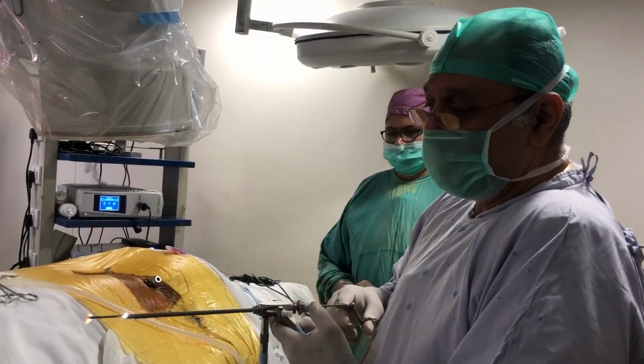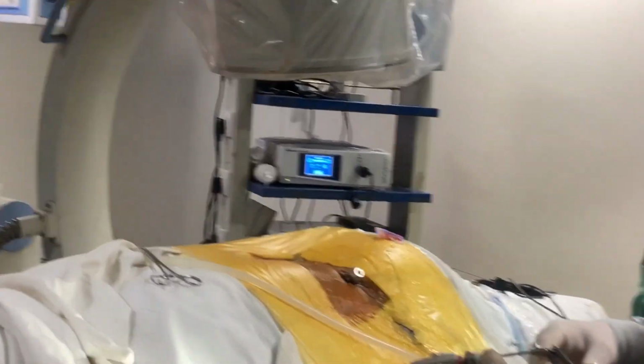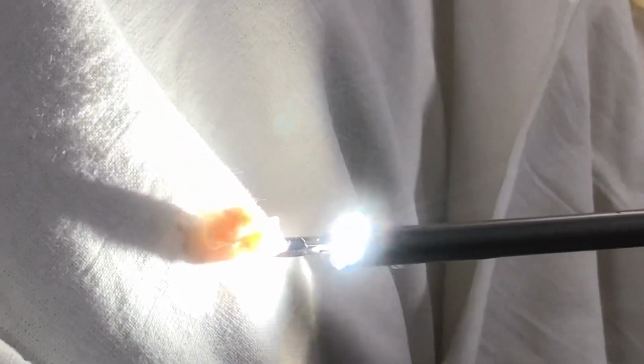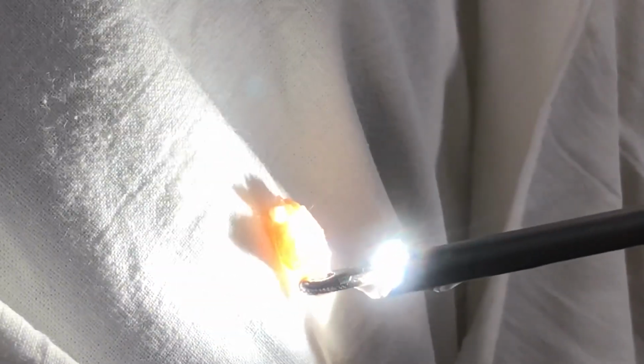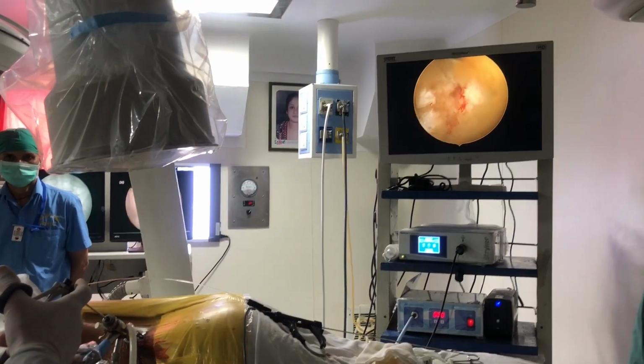As you can see, I have just put in my scope and I have pulled out a fragment. Now if you please come close and focus on this fragment. You can see the fragment is red and vascularized. There's a huge fragment removed by the scope and the grasper, but it is a vascularized fragment. It is red in color. This shows that the body was trying to repair the annular tear, but this huge piece of nucleus was within the annulus and not allowing it to heal.